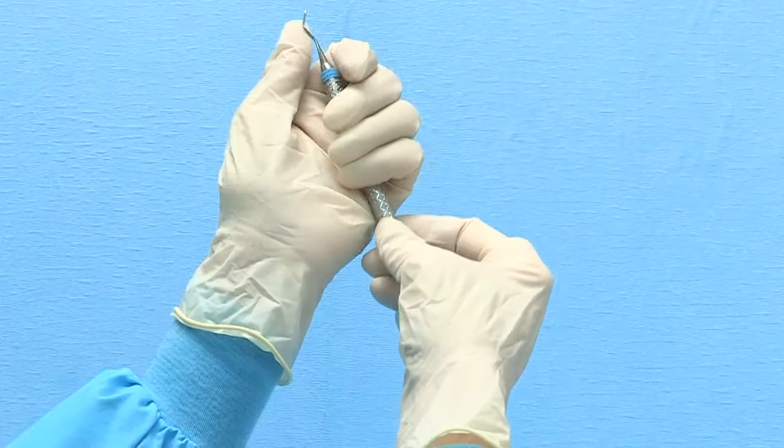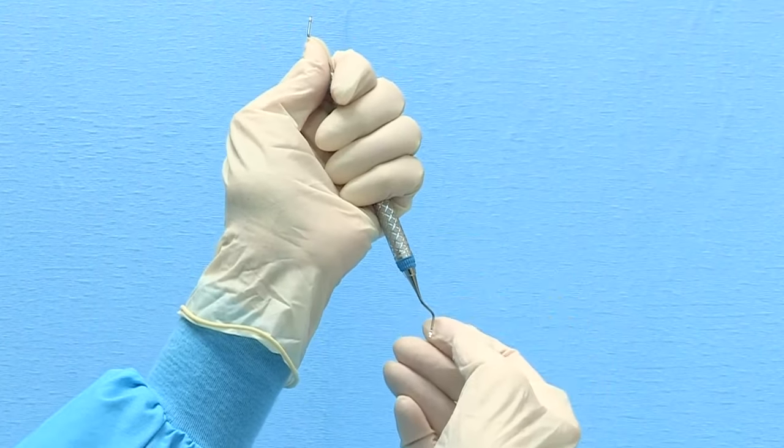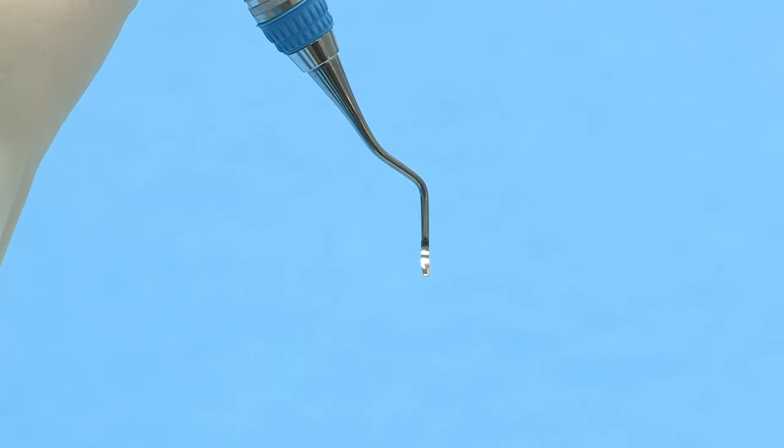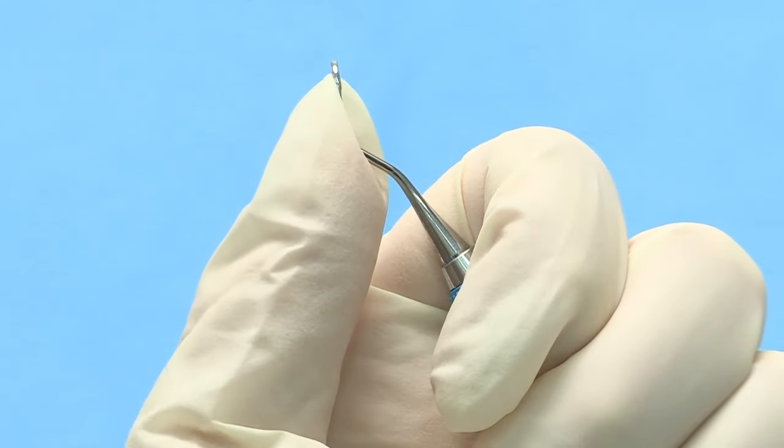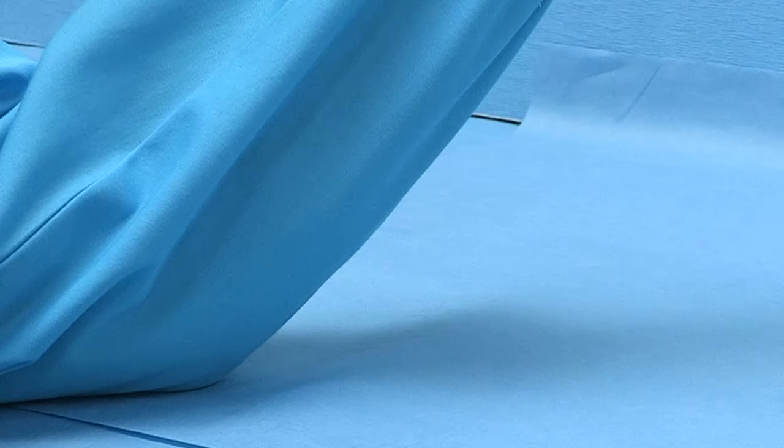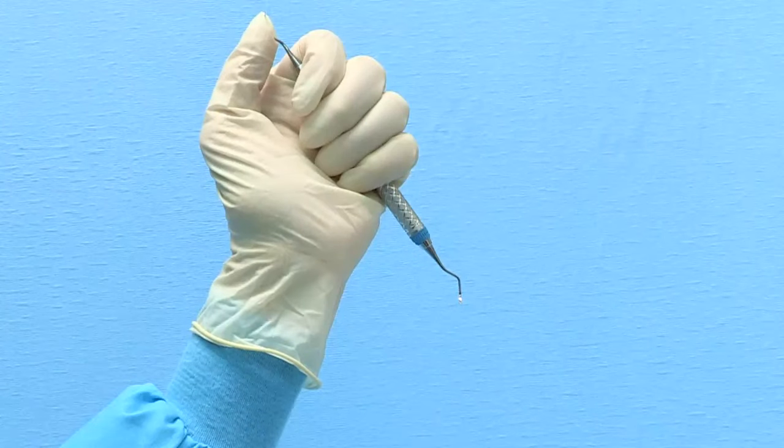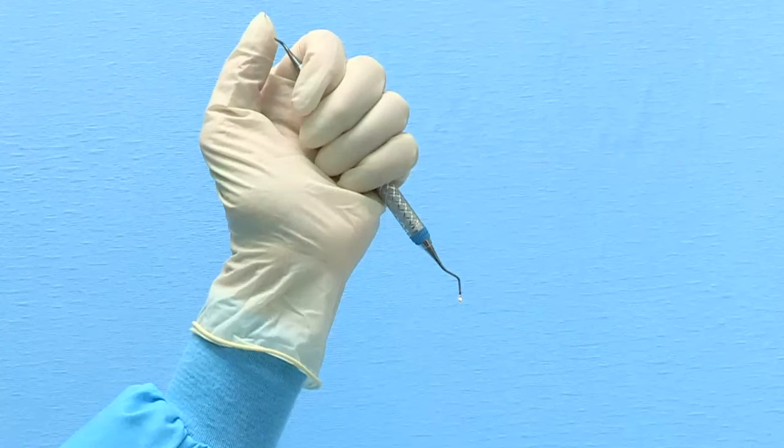To begin the sharpening process hold the Universal Curette vertically in your non-dominant hand. The blade to be sharpened will be at the bottom with the toe pointed toward you. Brace the top shank with your thumb and place your elbow directly in front of you on the table. This positioning is very important as it will counterbalance the pressure that will be applied when sharpening the lower blade.